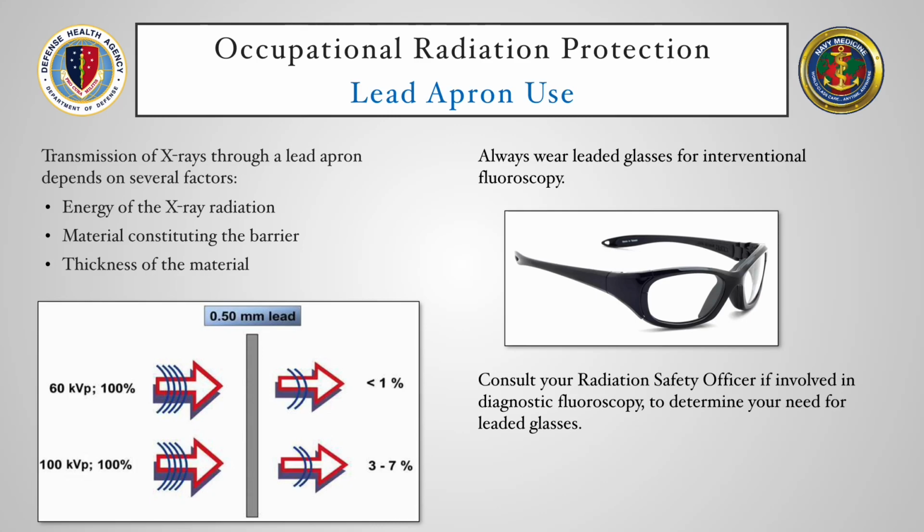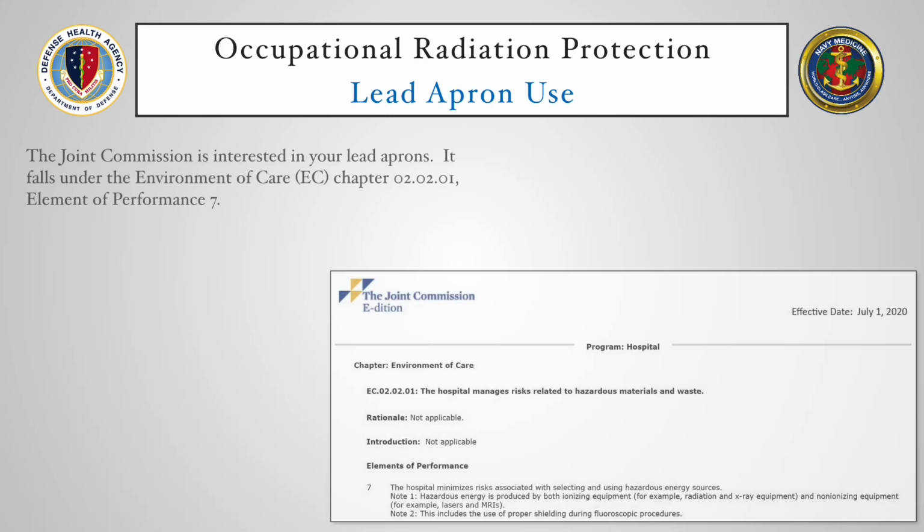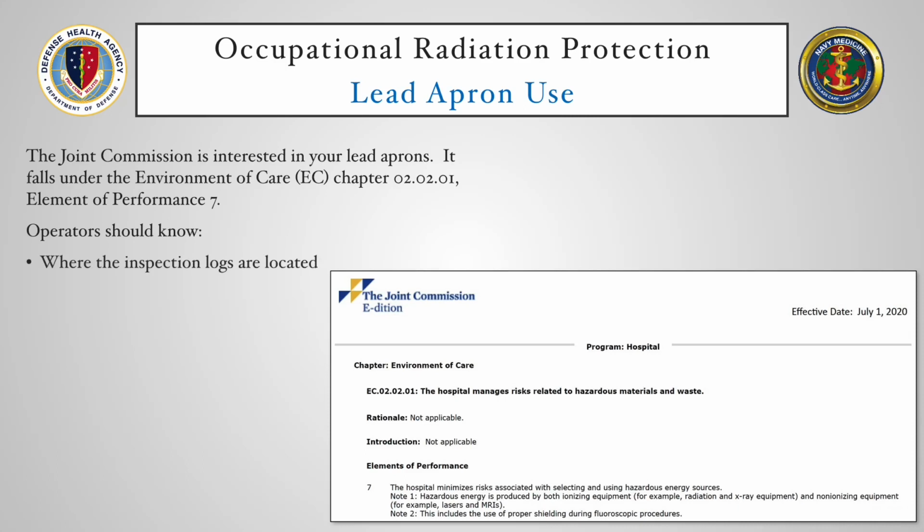One last point that we need to mention is that lead apron use is highly scrutinized by the Joint Commission accreditation. I've gone through 2 accreditations myself, and in both inspections they've asked various departments in my hospital to see lead apron inspection logs and have asked many staff members how they're checked, how they're used, and when they should be employed throughout various procedures.